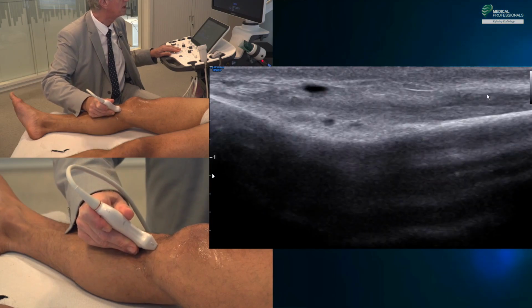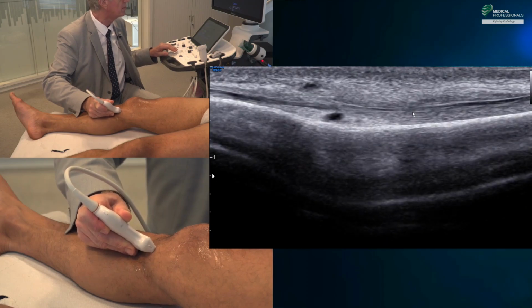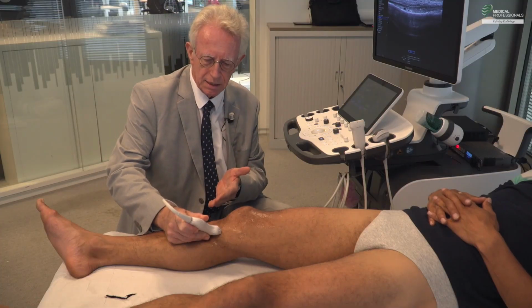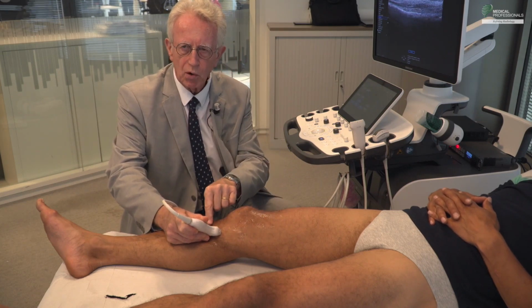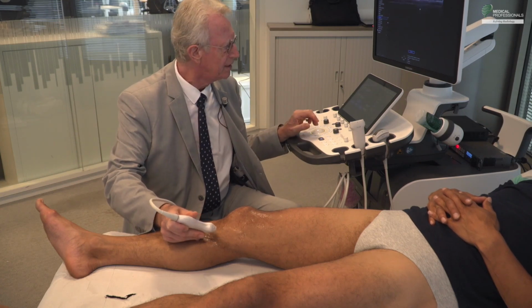These tendons can no longer be individualized at this location because they have fused to form a superficial lamina which, as we can see, is very distal. Do not imagine that pes anserinus bursitis is just below the joint line. It's really below the tibial metaphysis, and it's actually very rare.